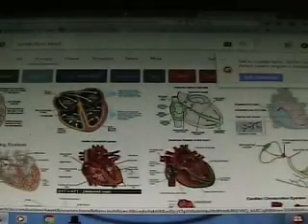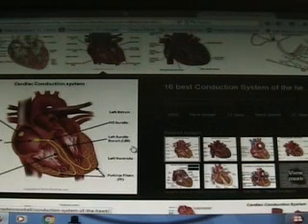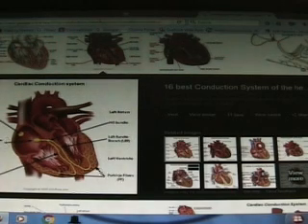And it kind of looked like this. Look familiar? Okay. So, we're measuring the electricity of the heart, and for the last couple of weeks we have focused on what was normal. What's normal? The SA node is our pacemaker. It fires to the AV node. That's the brakes. It slows it down, then sends the signal to the bundle of His, to the left and right bundle branches, and all the way down to the Purkinje fibers.